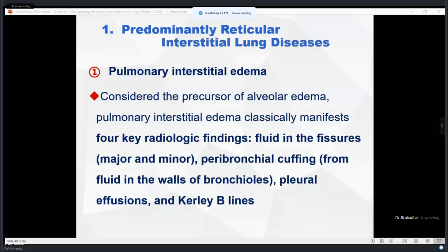Yes, fluid is present there, and generally interstitial edema will not show up as a bat wings appearance, but blood vessels being compressed doesn't necessarily mean it is interstitial edema. No, I'm saying that blood vessels being compressed is related to vasodilatation and vasoconstriction, related to BP, not related to oxygenation and ventilation. Yes or no, Shubham?